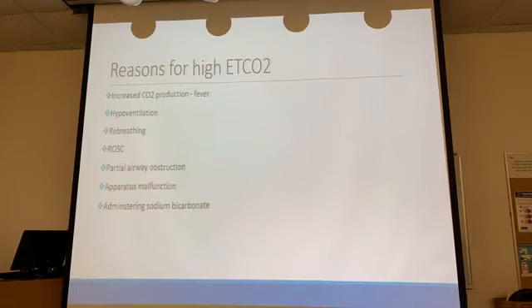ROSC, you go from low to high, check your circulation. You might have got a pulse back if you're in cardiac arrest. Partial airway obstruction. So how does that make any sense? Let's say you got a patient that's intubated and just half of the endotracheal tube, let's say they got a mucus plug, but they're still getting some air out. You're gonna see a difference in their waveform. You're not gonna have that nice rectangular waveform, but you might see a high end-tidal CO2. Why? Because that mucus plug is letting some of the carbon dioxide exhale, but a lot of it is getting blocked down in the lungs and it's just building up. Does that make sense? You have a partial obstruction.